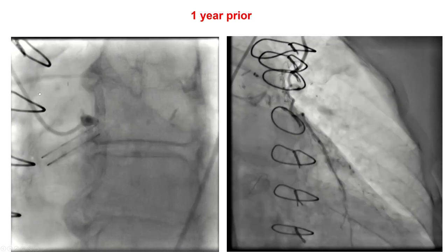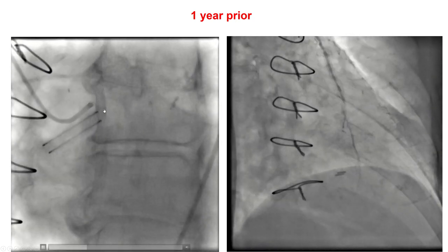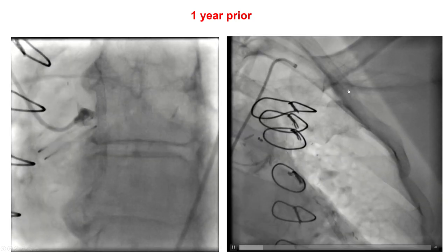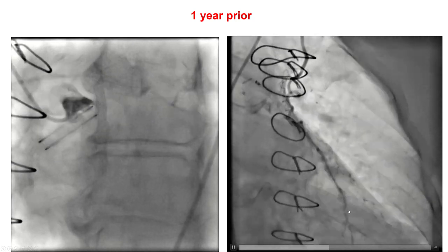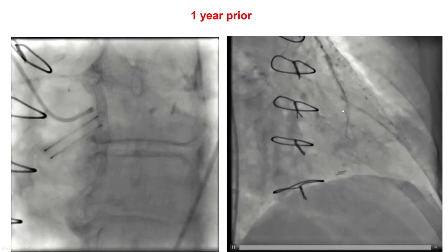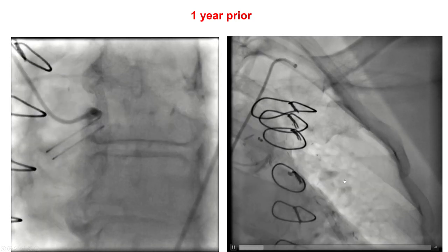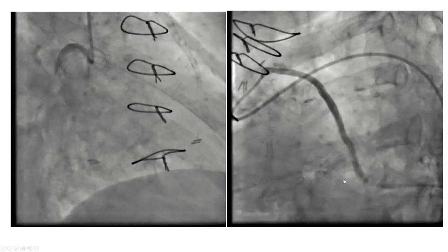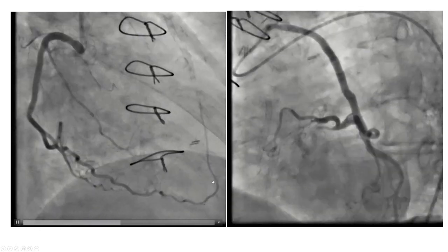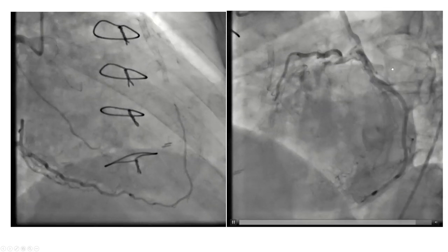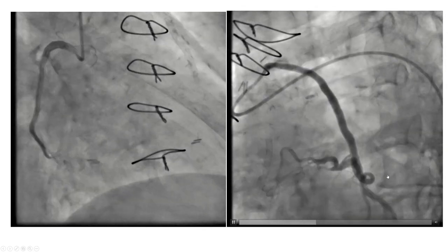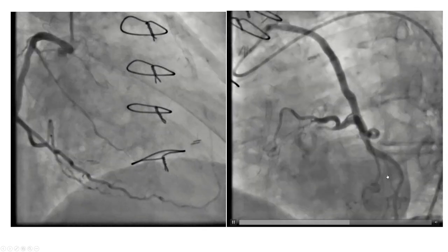Her angiogram from a year prior demonstrated a flush occlusion of the left main with a patent Lima to LAD, with some in-stent stenosis within previously placed stents and some antegrade flow. The native right coronary was patent, giving some collateral flow to the distal LAD, as was a saphenous vein graft to a large diagonal branch.